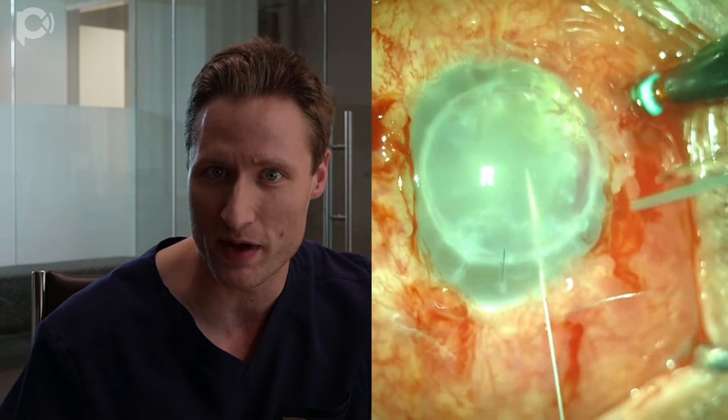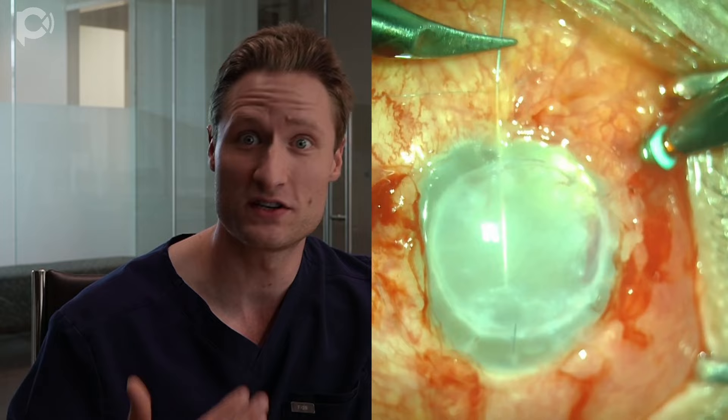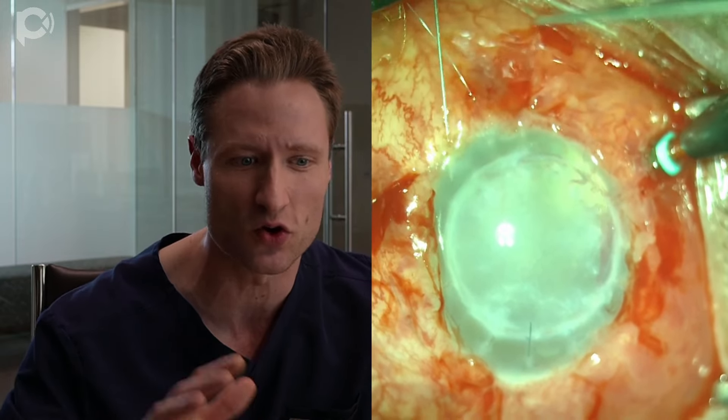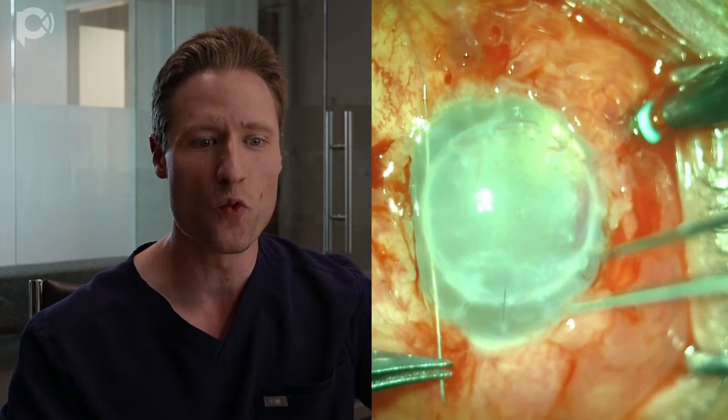This idea is not original with me. It came from a brilliant YouTube video from Bruce Allen, a corneal specialist in the UK, who described this technique of stretching prolene suture across the eye. I found that when using it, it's nice to use a long straight needle, which is easier to pass across the entire anterior chamber. You make between five and seven horizontal passes, then turn and make five to seven passes in a crisscross direction, creating a network of crisscrossing prolene sutures. You then tie those stitches outside the eye, and that creates a little trampoline for unfolding the graft on top of.